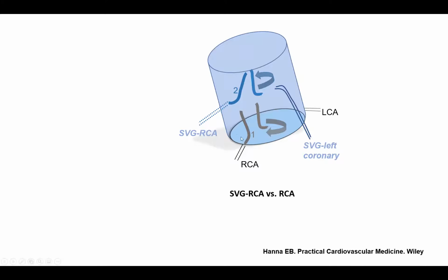Everybody thinks graft to the right is a little above the right. So if we clock to get into the right coronary artery, we must probably clock to get in the vein graft to right coronary artery. It is unfortunately wrong. A graft to the right coronary artery is counterclock. And it goes to my earlier idea about 180 degree in one direction doesn't lead to the same point as 180 degree in another direction.